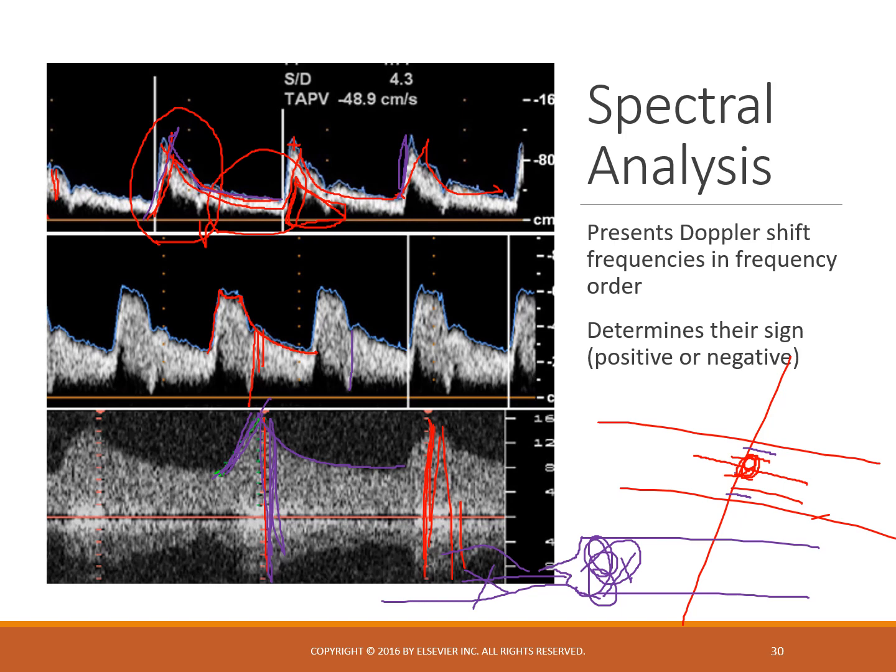Okay. In this particular case, the heart squeezes, but there's not much pressure behind you, so you kind of meander forward. As it stops squeezing, you kind of slow down, but you've got no resistance ahead, so you just wander forward. But you've got some people in your party that didn't push forward through enough, and they start winding around here in a turbulent state, and that's when we get them below the baseline. So the big terminology there would be envelope, spectral broadening, tardus parvus, and then looking for that turbulence.